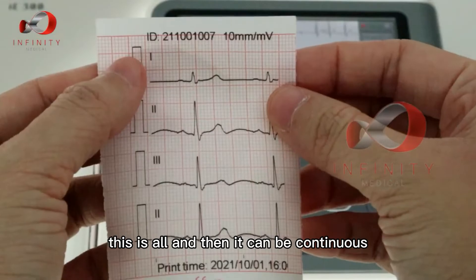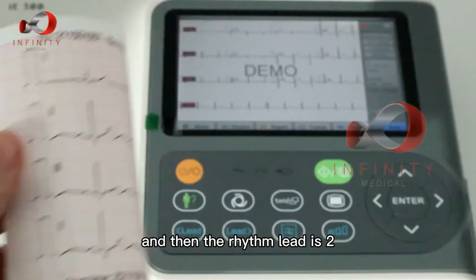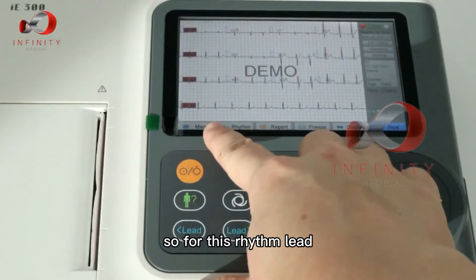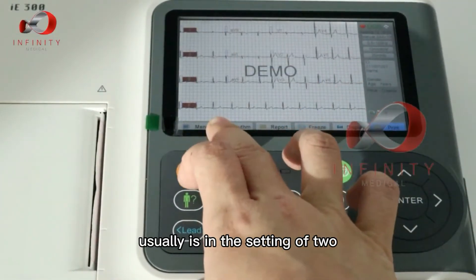You can see it prints continuously. The rhythm lead is set to lead two by default, but you can change it according to what you want — it's usually set to lead two.